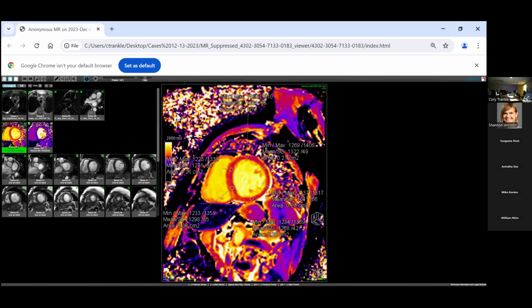So you can see all the little squares up in the left, that's out in air. They're kind of random. But around here, and Corey, you can use your arrow to point. This is a short axis view of the left ventricle, and the dark orange is the muscle in the wall. The yellow in the center is the blood pool. And then over here on the left side of the image, the right side of the patient, is the right ventricle, and it has a much thinner wall.